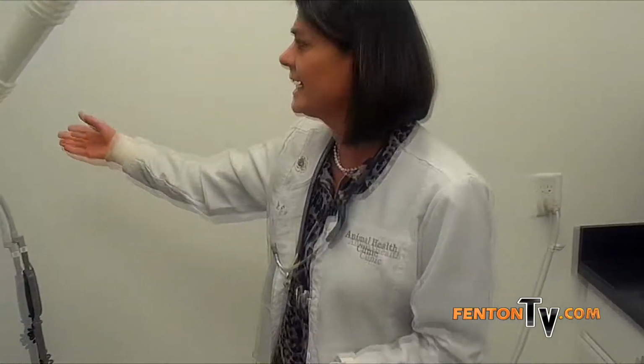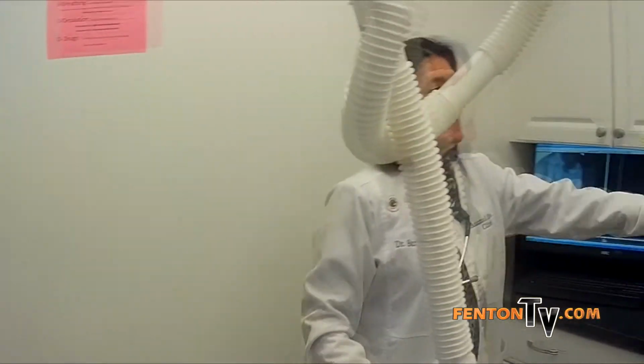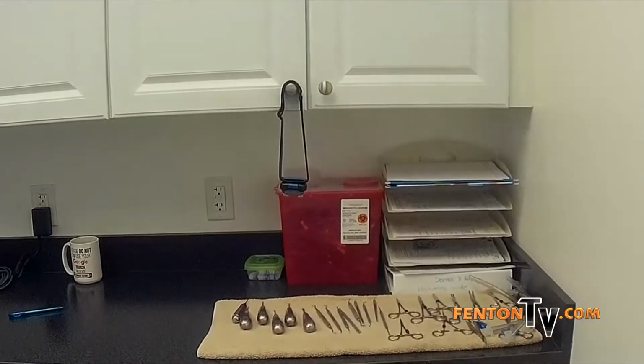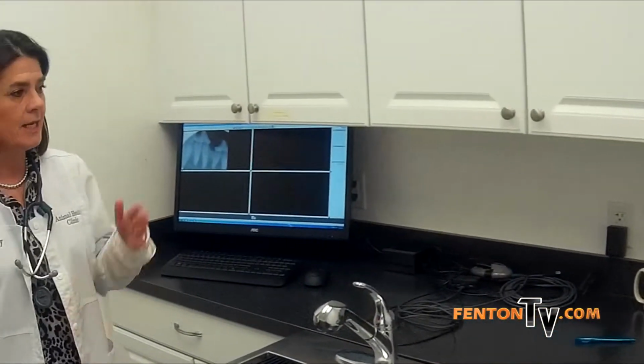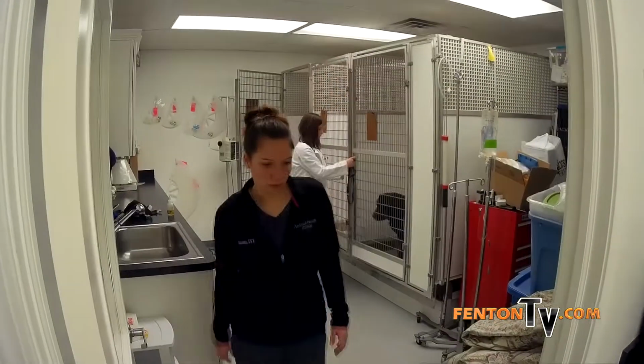We also have a dedicated light because we're working in a dark oral cavity, and we also have these funny little gadgets over here for magnification and increased light that we put on our heads, they're headlights, and we can look down in the oral cavity and get a better idea of what's going on.